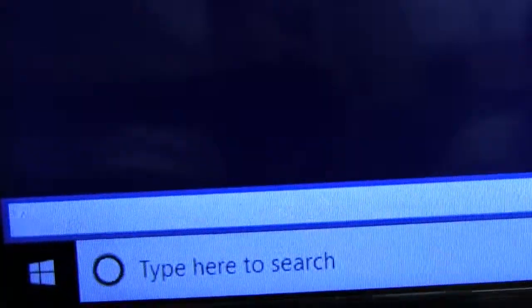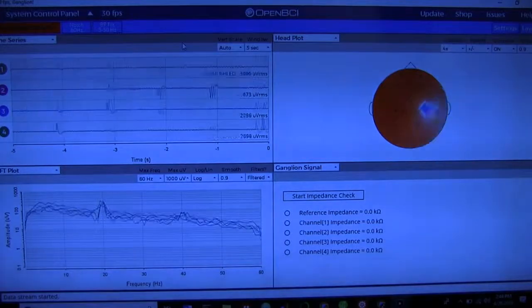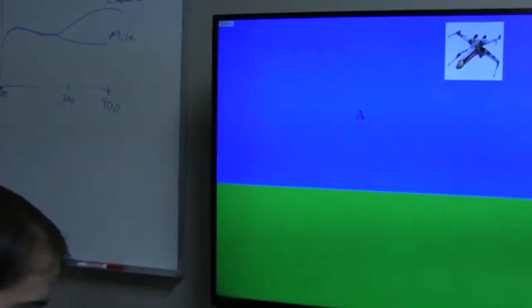We had a lot of issues getting a good SSVEP signal from the BCI device, so we were unable to get a working demo. But we did develop a mock-up of what the user interface would look like. The way the Brainlander page will work is by having a question asked verbally, and then the user will focus on the flashing stimuli next to their desired answer.